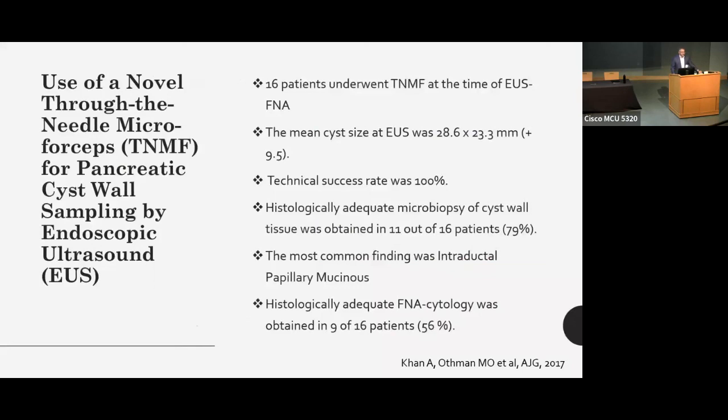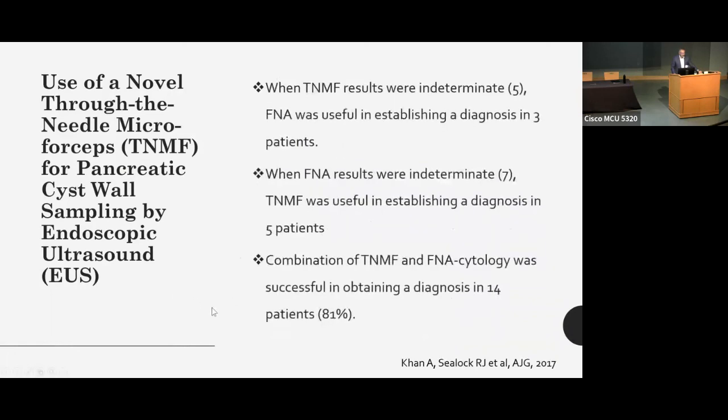I saw the bleeding happen in the cyst 1 or 2 times. I can see the cyst full of blood, but it was never something that led to a problem or the patient had pain. I think this case of death that was published was related to severe acute pancreatitis. I don't think anyone else has had a death from using the device. I still use it, but I'm very cautious about using it in every case. But I think it is a great device and it helps.